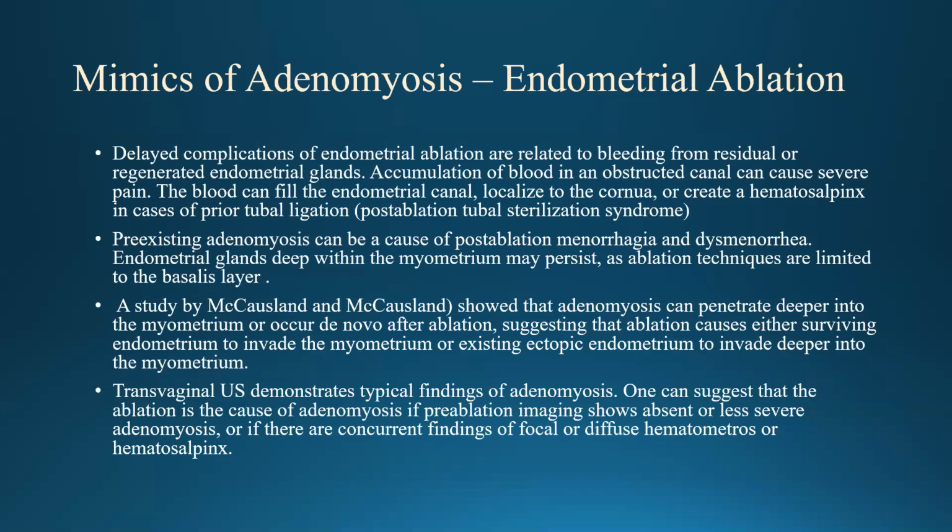And in these cases, there would be a picture on ultrasound. If you do a scan after endometrial ablation for the patients, you would find a picture that looks like adenomyosis, and I'm gonna tell you how to differentiate this clinically.